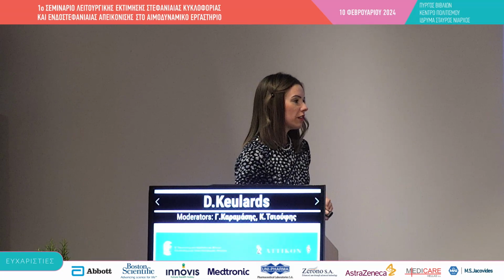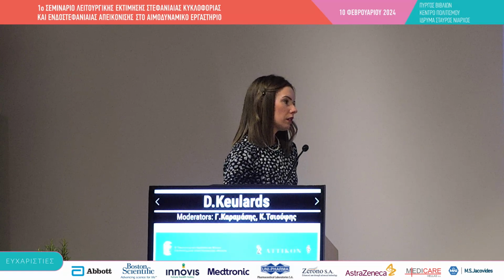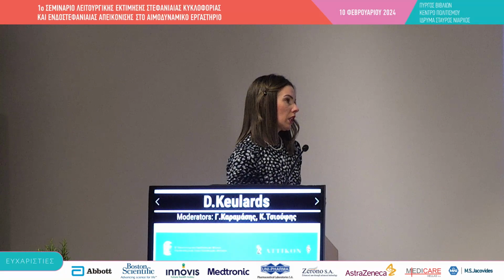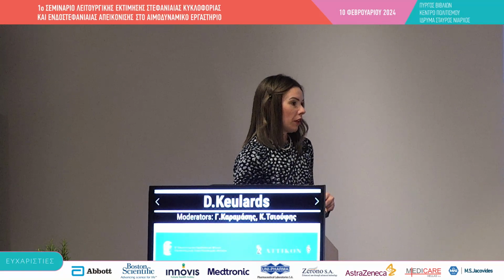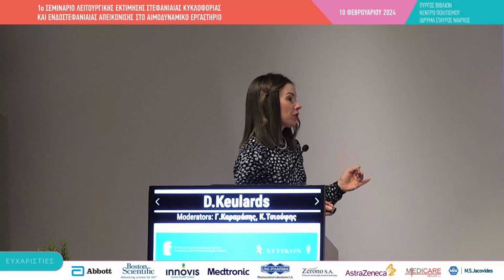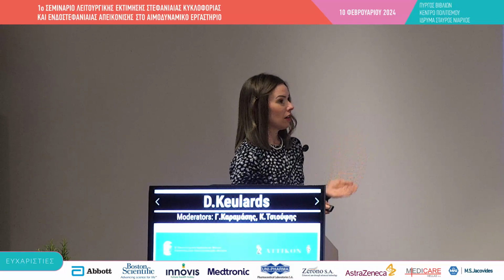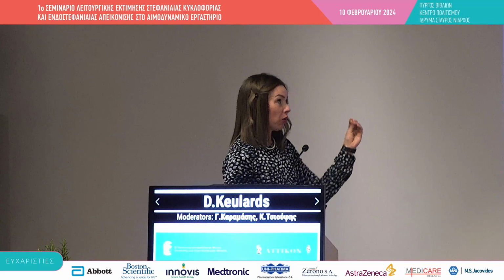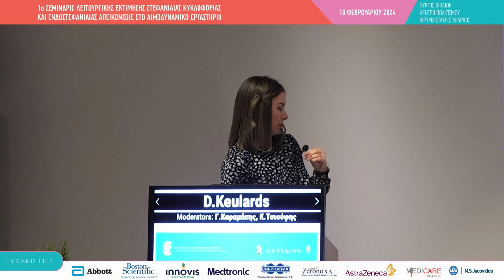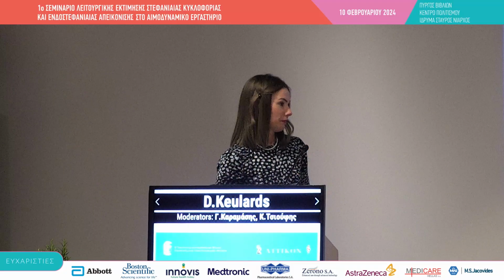If we then trust the measurements of IMR? It's not healthy at all, but there is a moderate stenosis on the epicardial vessel. Well, the MRR isn't affected by epicardial stenosis, but what I explained, the flow IMR is. But what you then can do is advance the RayFlow beyond the coronary stenosis and still measure the distal part.